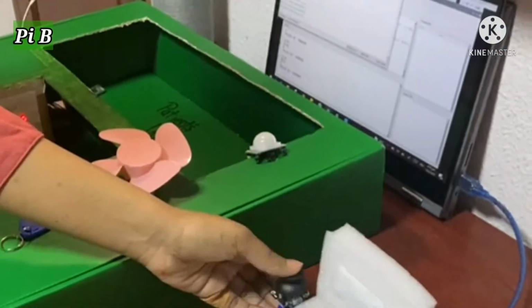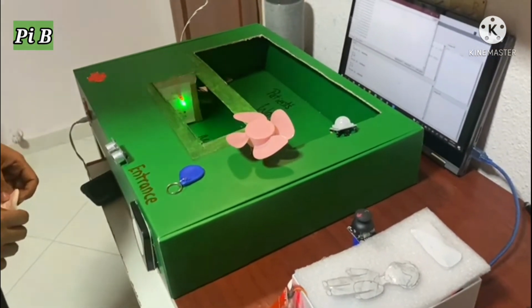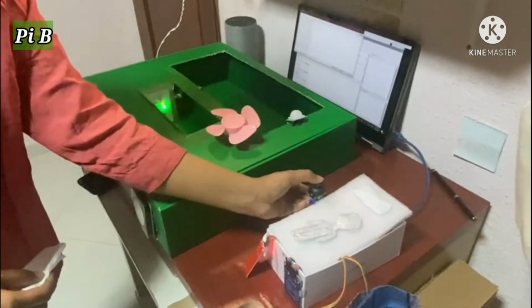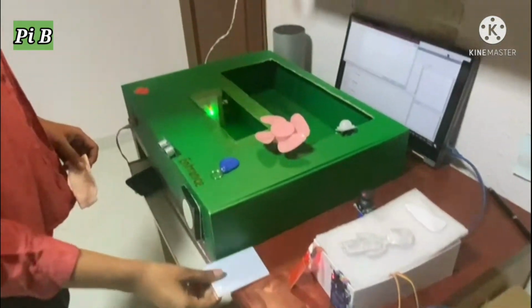There are three ways to seek for help. One would be the help call button inserted inside the joystick. The light at the MU room will only turn off once a staff taps their card. Even if a person pressed the button multiple times, nothing would happen until the nurse taps their card.